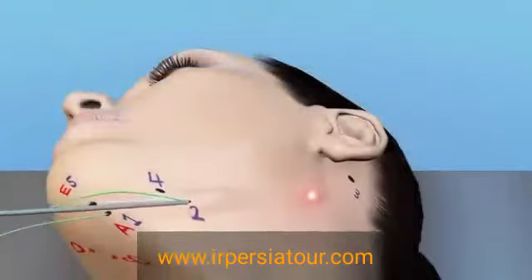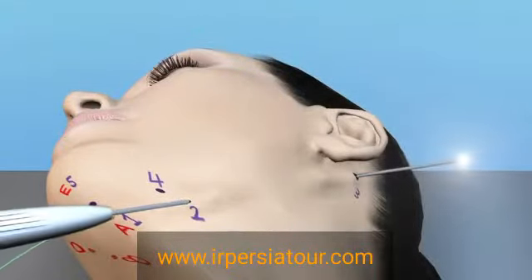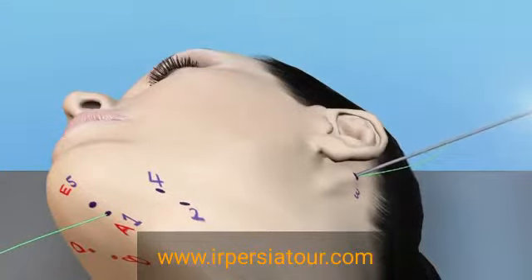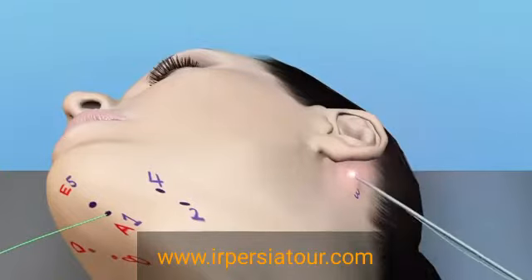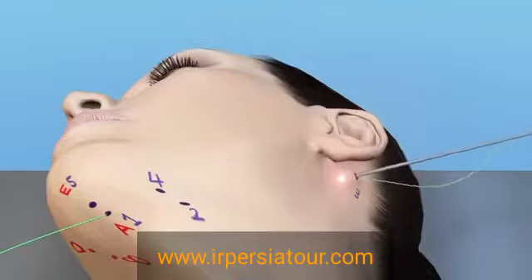The rod is then carried about and around the angle of the mandible up to point 3, where the rod is brought out until approximately 1 centimeter of the tip still remains in the subcutaneous plane. The external portion of the rod is then rotated downward, allowing the internal portion to rotate upward, oriented towards the medial canthus of the left eye.